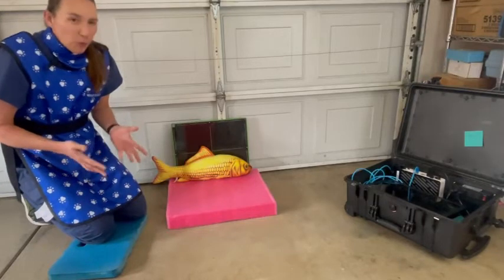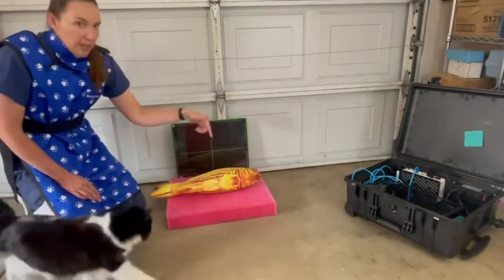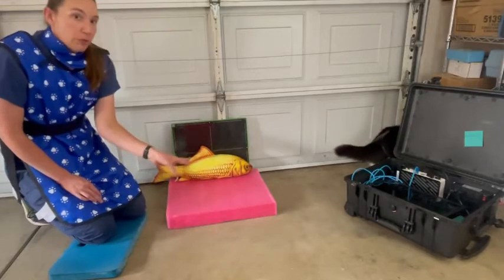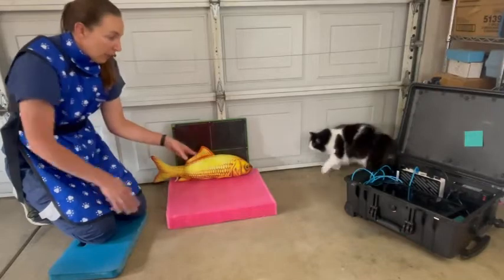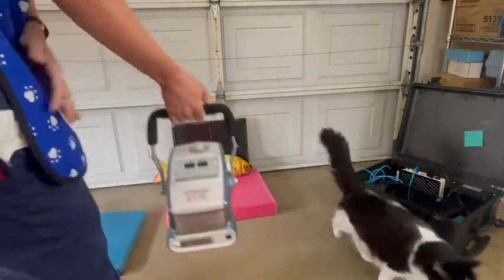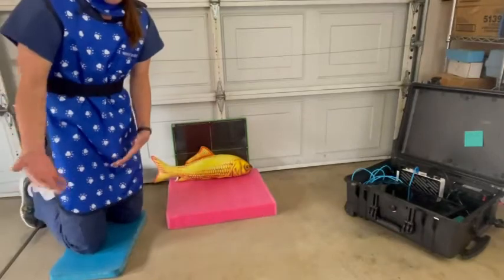For any fish that are having problems with buoyancy, we want to take a really close look at the swim bladder. If we're going to do just a regular lateral and shoot them straight down, and there was say a pocket of fluid in the swim bladder, we really wouldn't see it that well. By propping the fish up like this, we're able to shoot through the swim bladder so all the fluid would collect in a pool on the bottom — that way we'd be able to see if there was fluid in the swim bladder or not. We get this positioned, take the shot, and then the fish again will go back into the sedation.